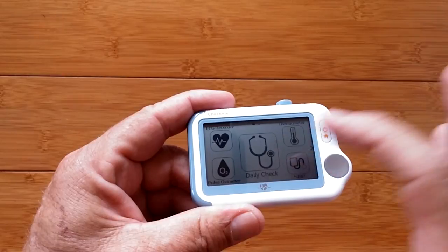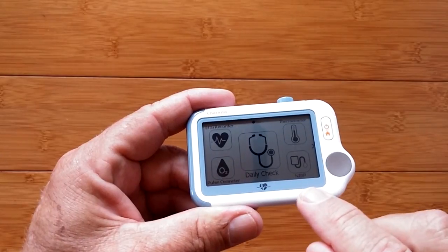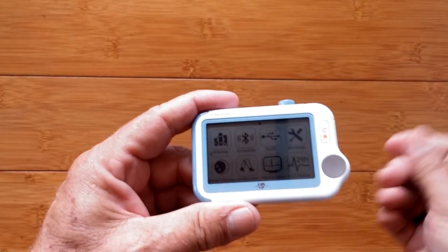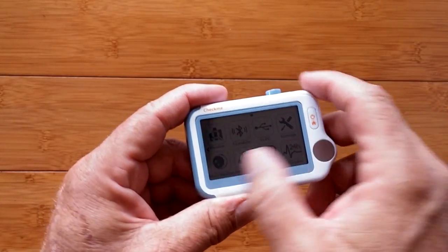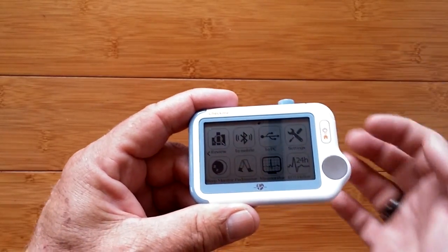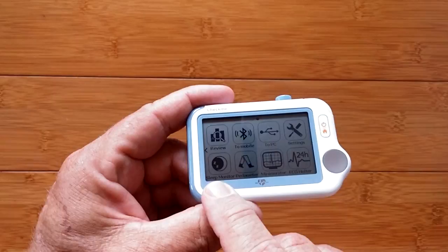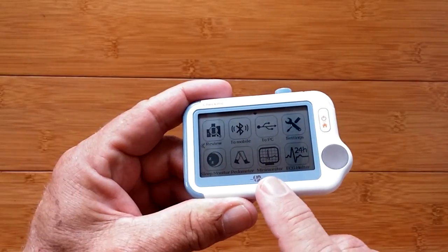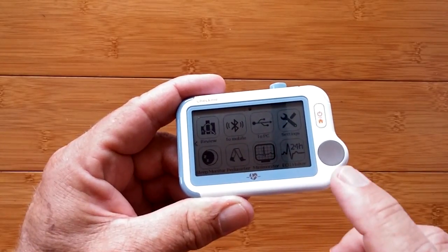On the main page you've got ECG, blood oxygen, thermometer, blood pressure, and NIBP — non-invasive blood pressure reading — if you hook up the cuff. Page two includes reviewing your data, Bluetooth connection to mobile, wired connection to PC, overall settings, sleep monitoring for all night, a built-in pedometer, a mini monitor capability, and a 24-hour ECG capability in Holter mode.